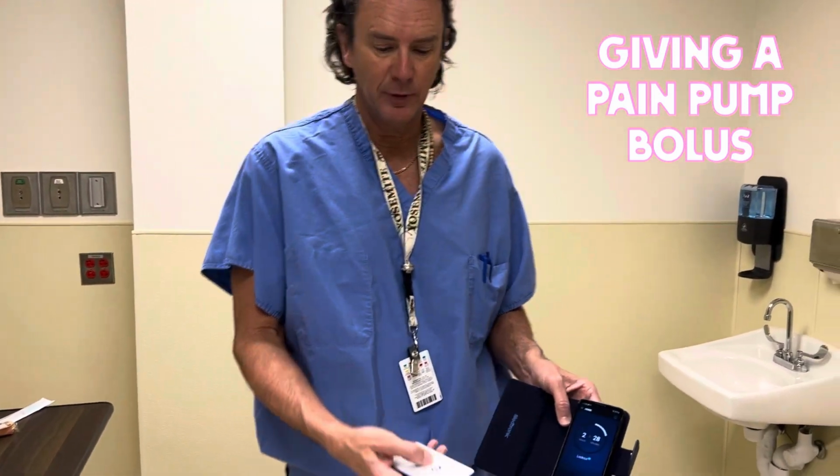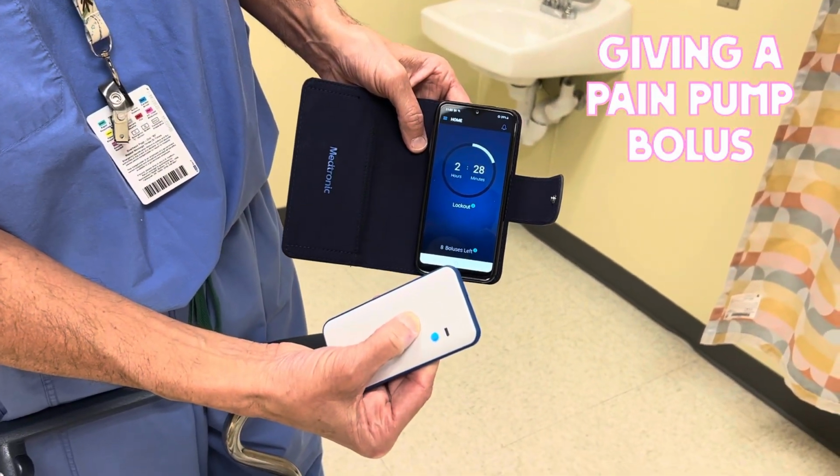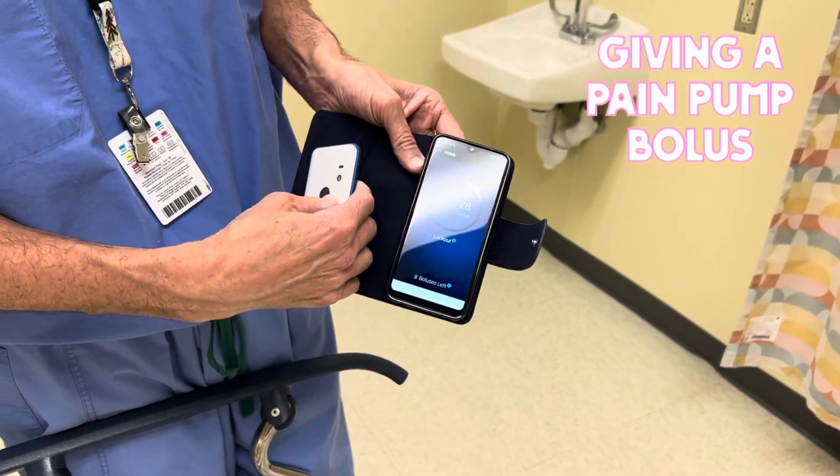Once you're done giving the bolus, you want to press this button in the middle down again and hold it down until the blue light goes off. When it goes off, it's off. This will go back in this pocket.